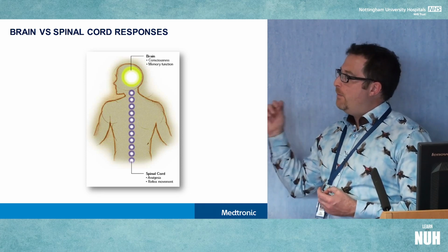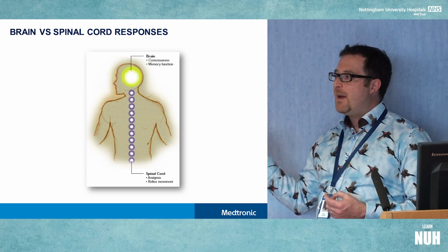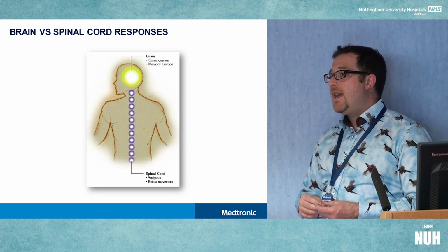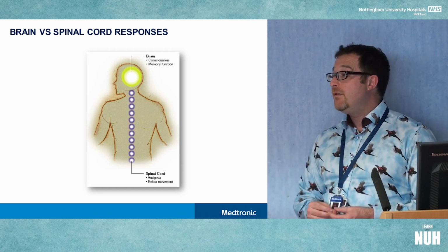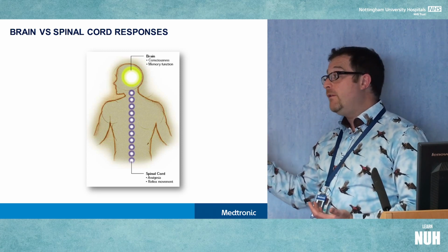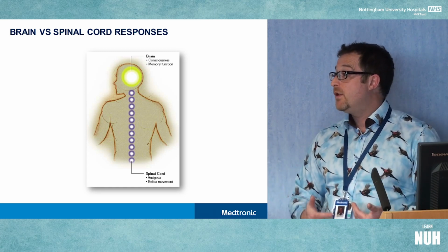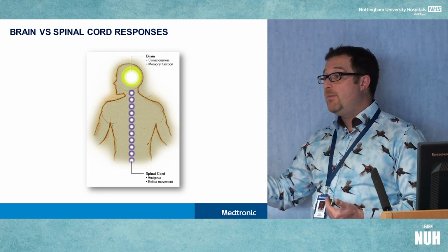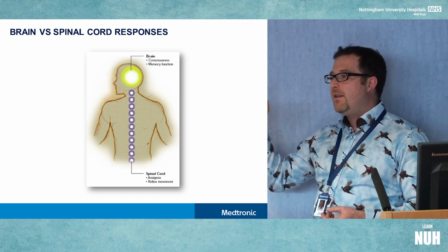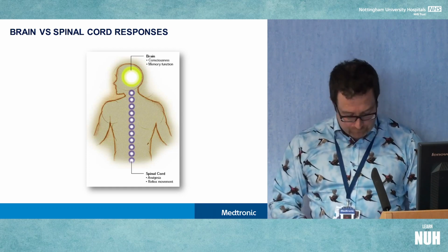The difference between what BIS can show you and what you'll sometimes see in relation to movement or hemodynamic changes is very important. You may potentially get a CNS precipitated, spinal cord mediated response from surgical stimulus or low analgesia, where the patient will move, and heart rate or blood pressure could increase, but the BIS may not change. Sometimes you're going to see the BIS change or creep up, and then you'll see those hemodynamic changes as well. So BIS is a better presenter of the target of reactivity in the individual patient than your hemodynamics alone.